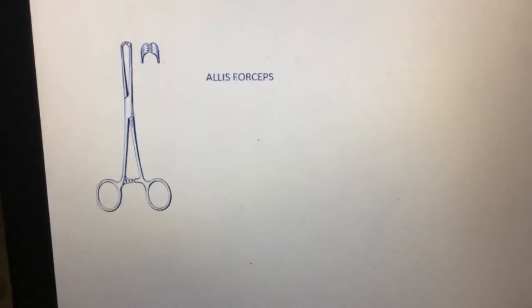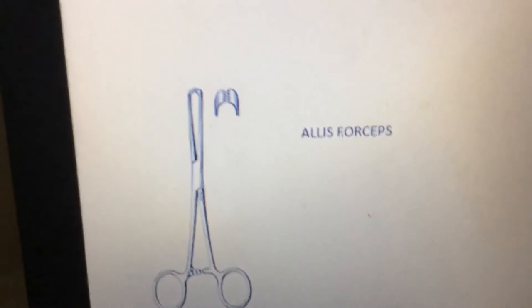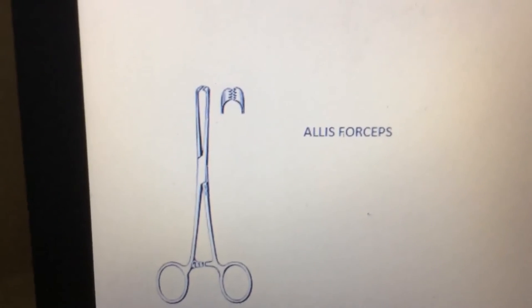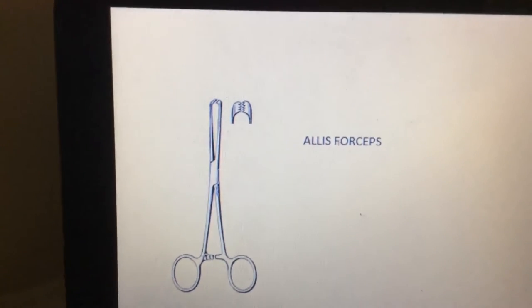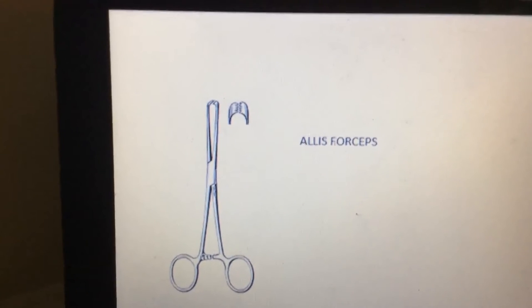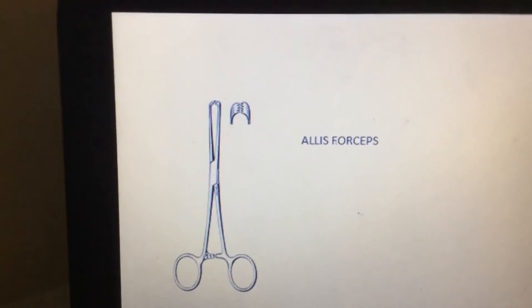This one is the Allis forceps. The tip of the Allis forceps is like a cat's jaw. It is mainly used to grasp tissues, for holding intestinal tissue, and also used for holding other tissues.